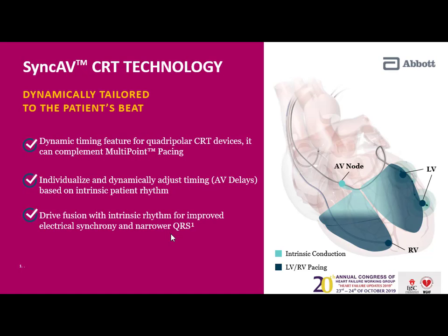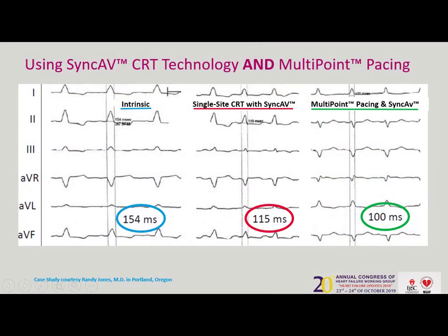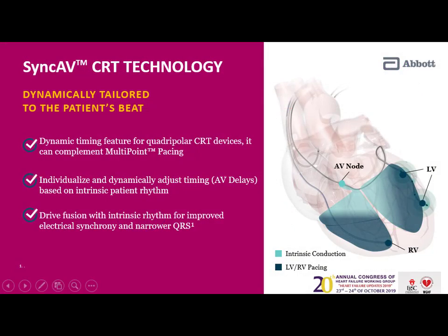And if you do Holter, you will see it. The pacing is not effective because of the fast conduction. Now, if you use this technology and you synchronize with the native conduction of the patient, now you solve many problems and you avoid RV pacing.